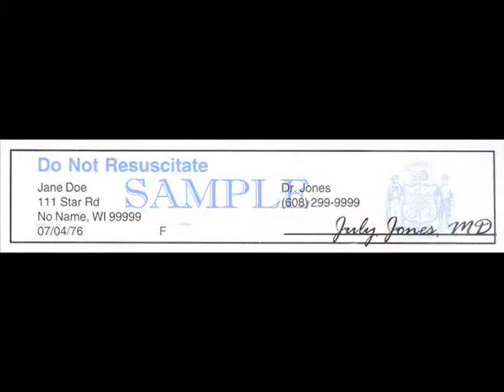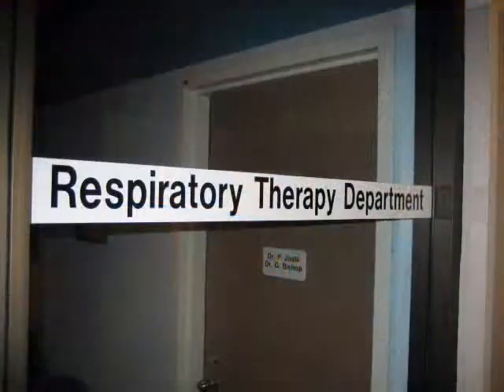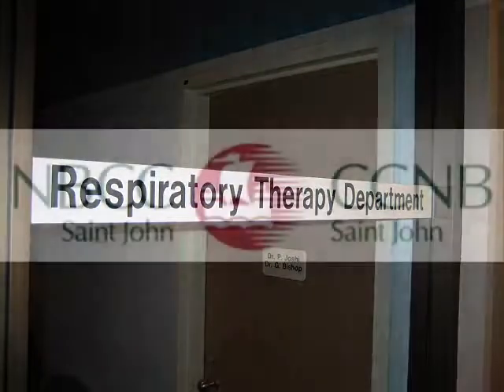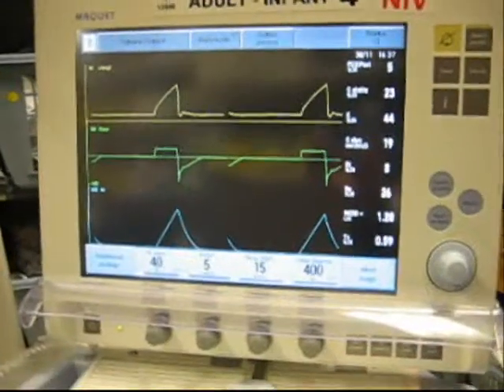Identify the patient, yourself, the department that you represent, and your role as a respiratory therapy student at NBCC SJ. It is also at this time that you should explain the procedure and confirm patient understanding as appropriate.